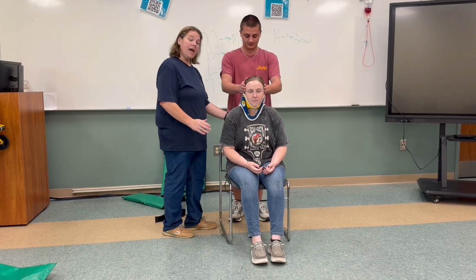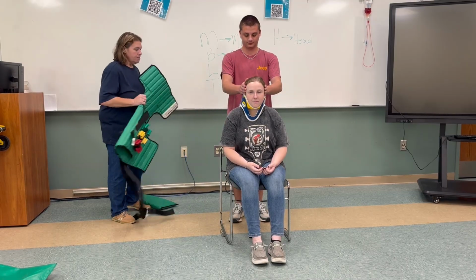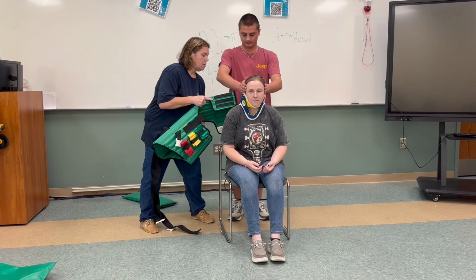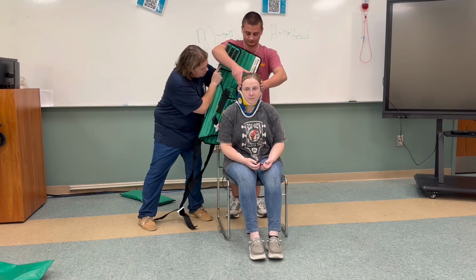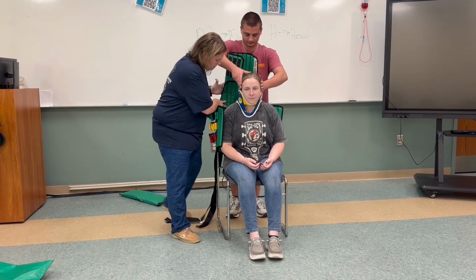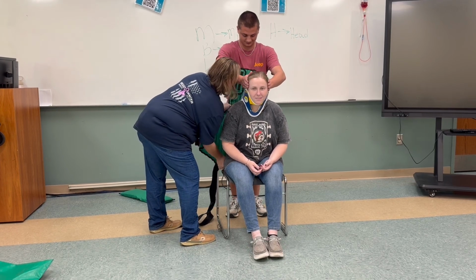All right, so we're there. Now I can place my KED behind her. You will have to go up under your partner's arms. There we go.